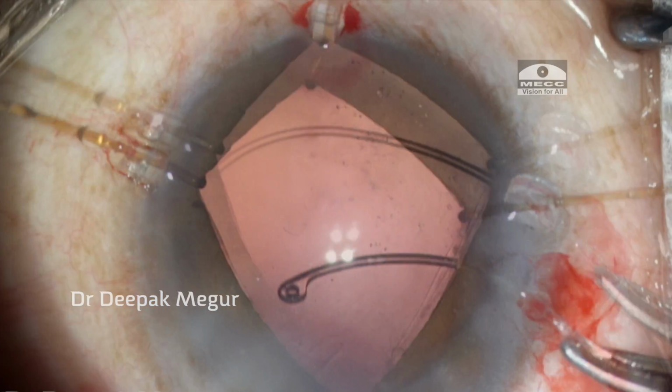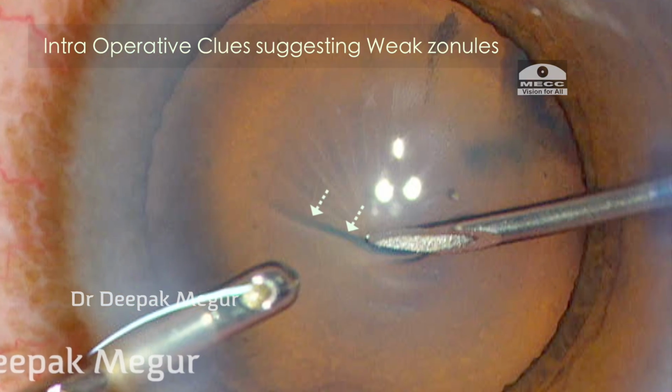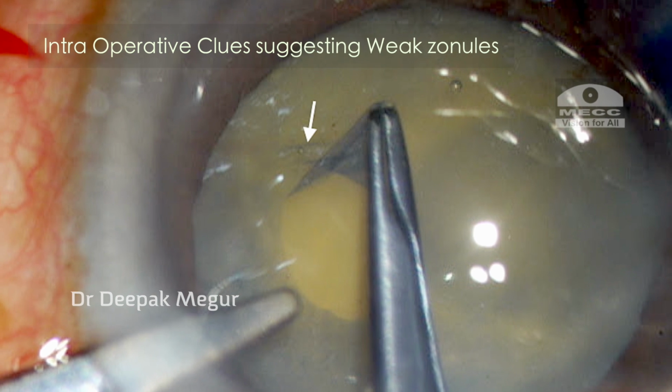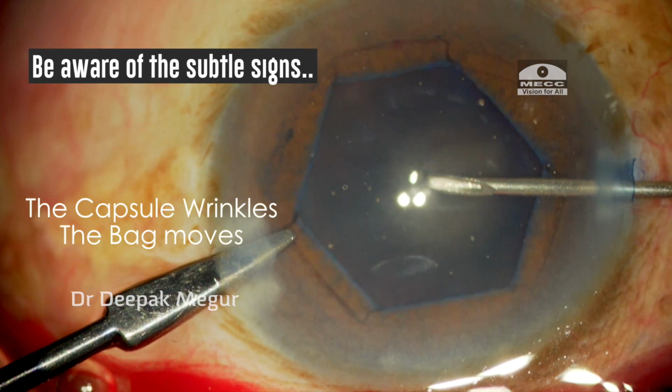Before learning the techniques of CTR insertion, let's understand what the intraoperative clues are that tell us we may be dealing with an eye with weak zonules. Many times we actually realize during surgery that the zonules are weak. There are certain subtle signs which we need to pick up.